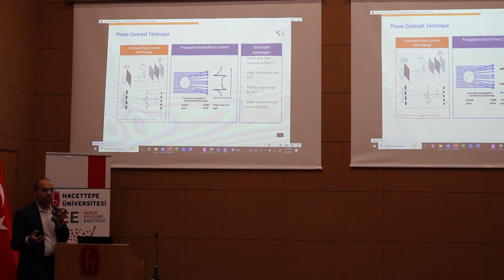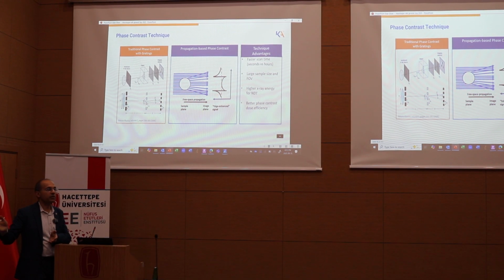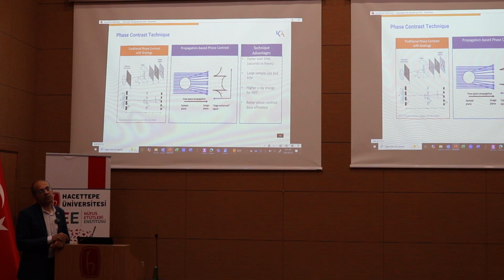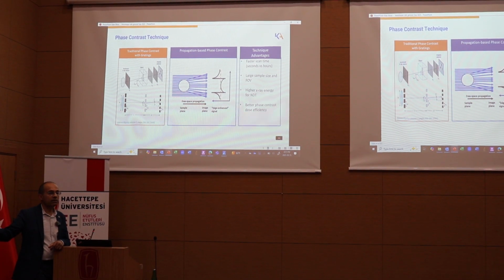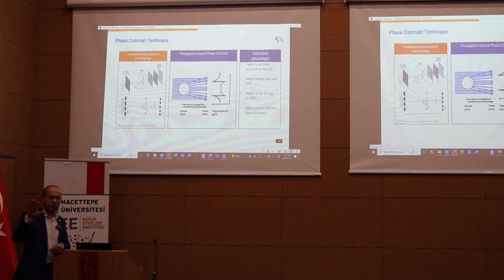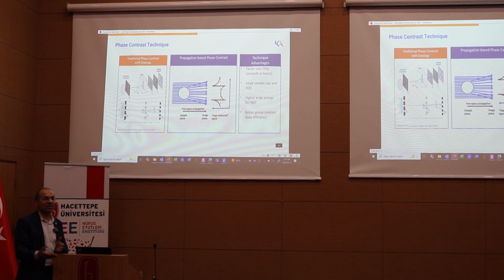It's tiny. But if you have enough distance, even a 1 microradian variation can result in a very large interference pattern. In fact, back in Australia, maybe 30 years ago at the synchrotron facility, they demonstrated this for the first time. They looked at the phase change and they showed, when they put a detector about 10 meters away from the object using a very powerful X-ray source, they showed the phase change. Now, practically speaking, you can't put the detector 10 meters away, otherwise you need a synchrotron.